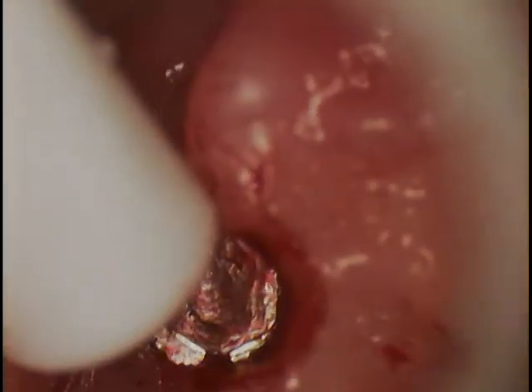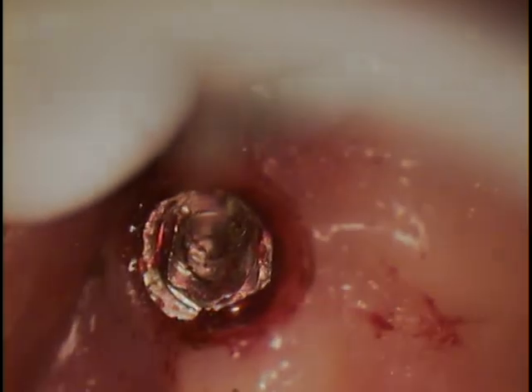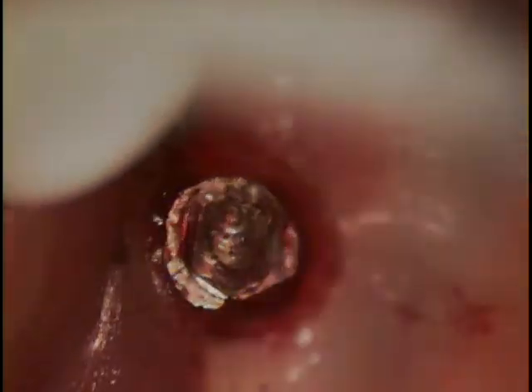There's no need to pre-soak at this point. We're going to test it for mobility. Obviously it's cold welded, which means metal to metal — there's absolutely no movement. Right about here we'll have to put a small pilot hole, and we'll try to do a little slot and drill out.